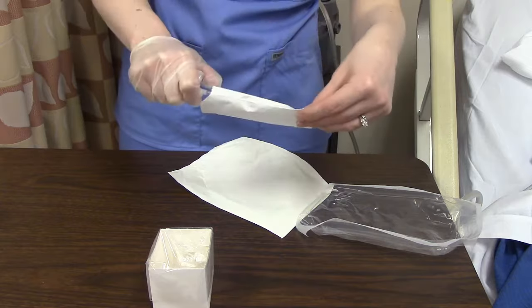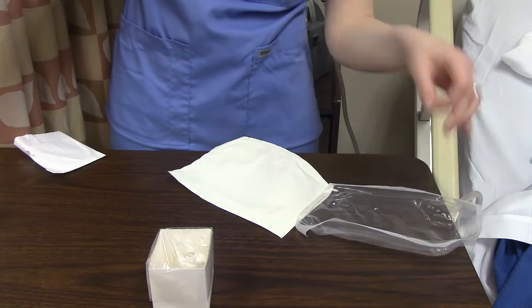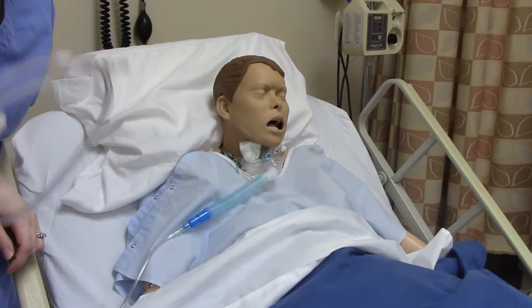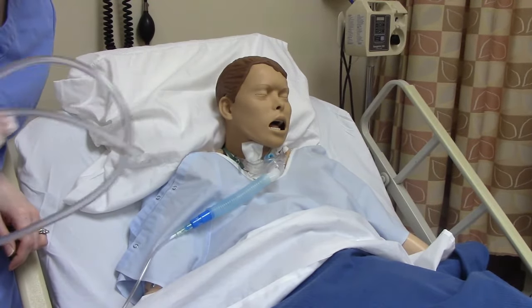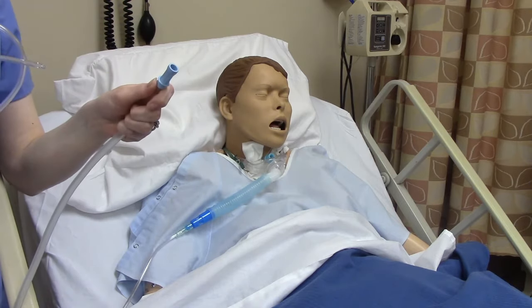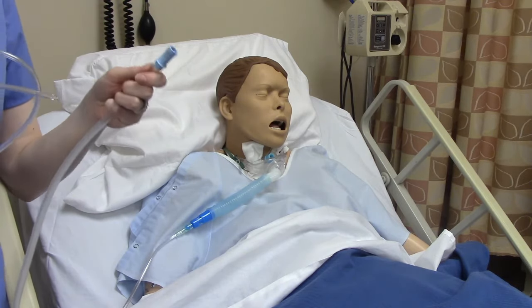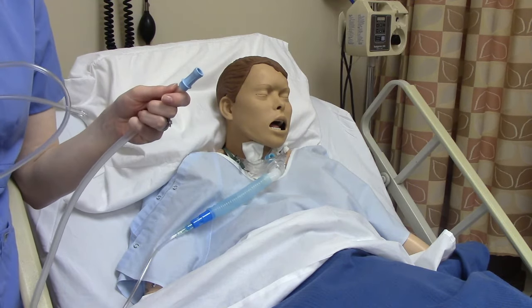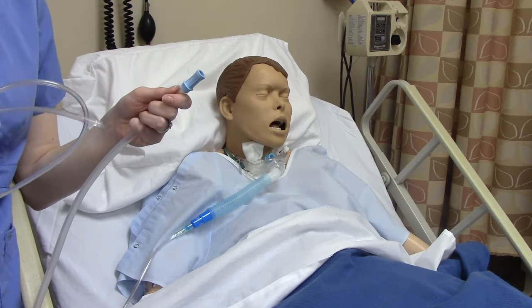We can take this paper part off and get rid of this bit. Now what we need to do is hook up our suction device from the kit to the suction at the bedside or attached to the wall, depending on where you're doing care. In a nursing home it might be on a little bedside table; in the hospital it's definitely going to be on the wall.